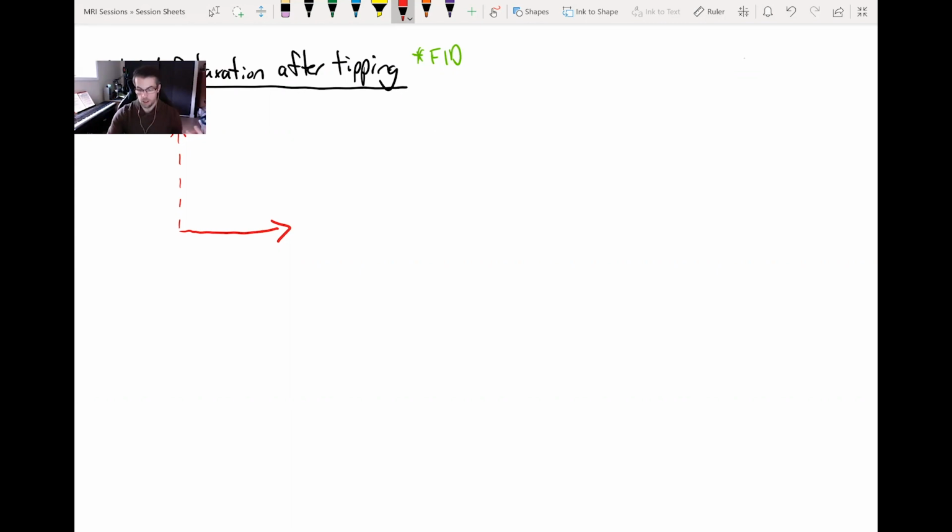I took these engineering courses like 7 or 8 years ago, but my intuitive understanding of the law is that if you have a magnetic field that is changing near a conductive material, then that magnetic field can induce an electrical current in that conducting material.